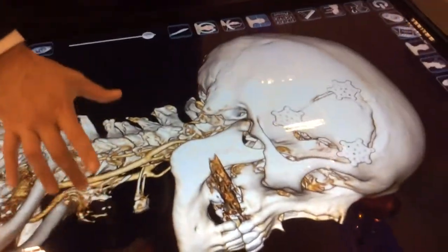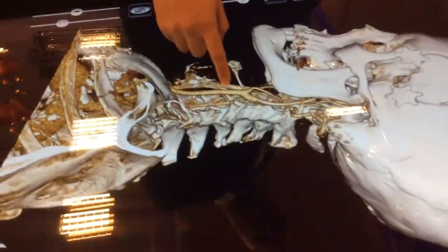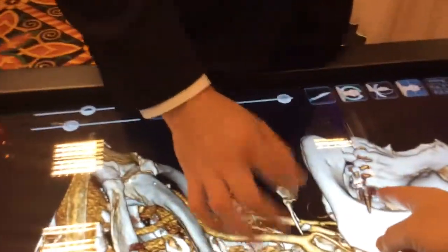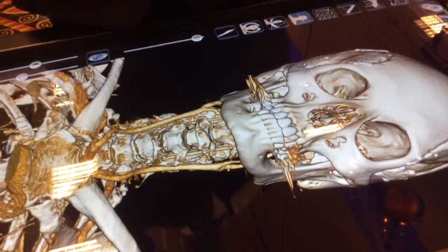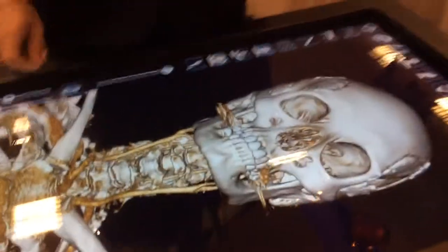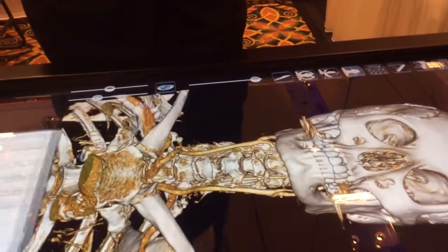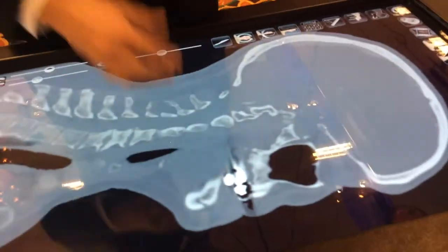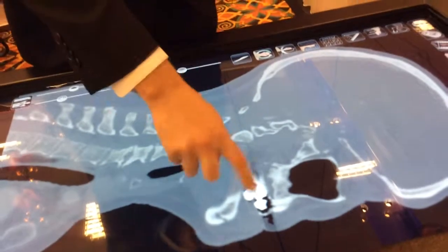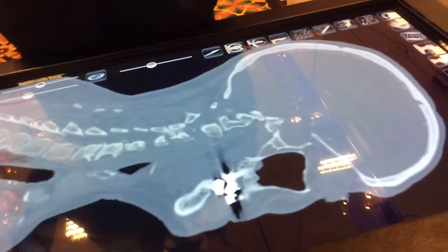So here, this was a post-op scan for an aneurysm clip surgery. And what are these gold parts I'm looking at? That's blood vessels. This is scatter from the fillings in the teeth. So there's just digital artifacts basically. Actually, even if you go into the original slice data here, even if they were just looking at the raw slice data, they'll still see this scatter. So there's not much that we can do about eliminating it.